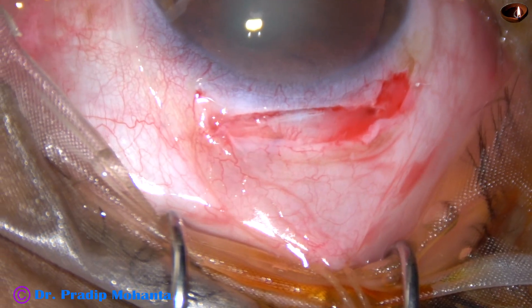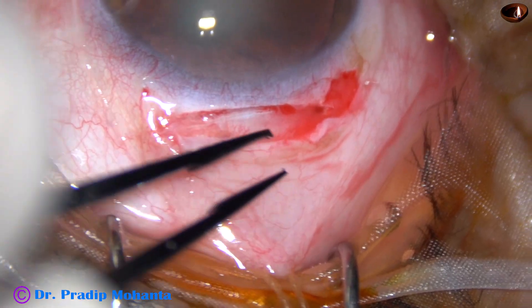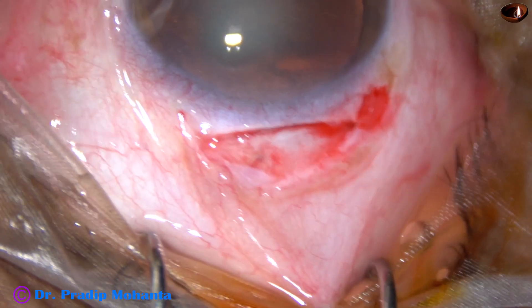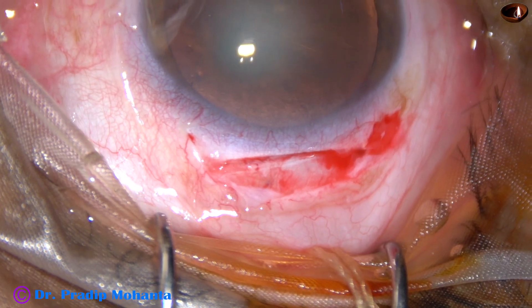It's a frown incision. The inner aspect of the tunnel is wider than the outer aspect.